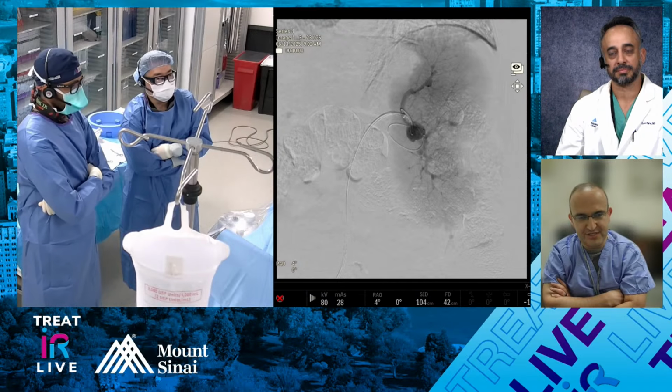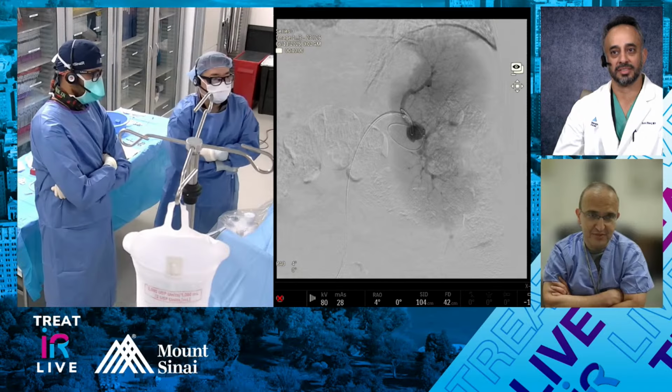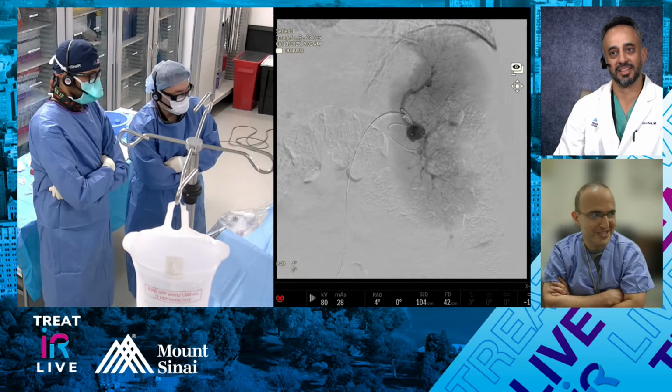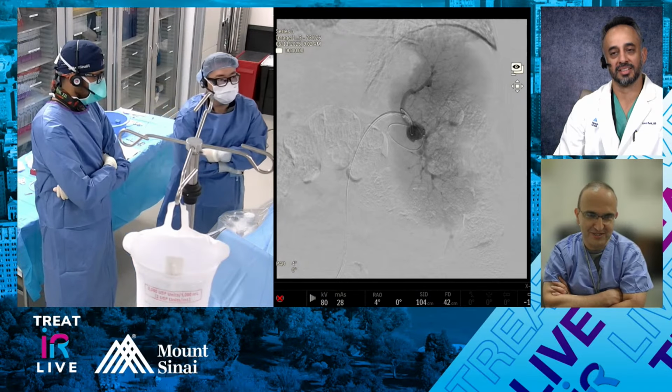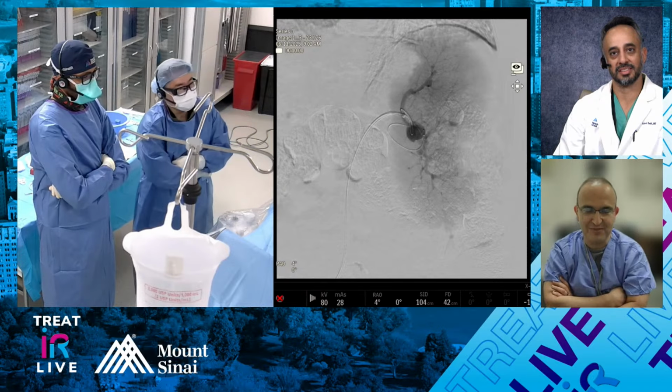Yeah, just like you were saying, when you get these cirrhotic patients, their aneurysms are almost always at the hilum. I wish we got some aneurysms proximal enough for a stent graft. I think in our whole life we had one case where we could put a stent graft across the proximal aneurysm. And most of the time, like you said, they're especially in these patients in the middle of the hilum.